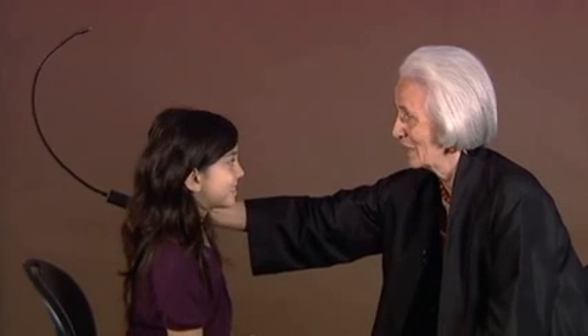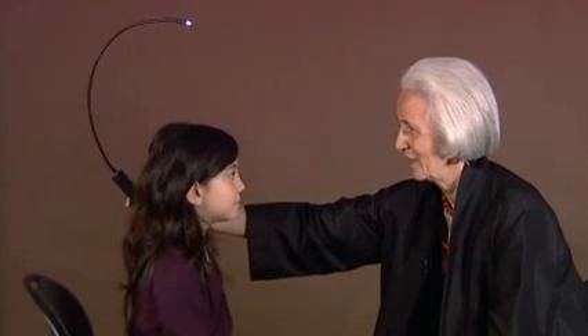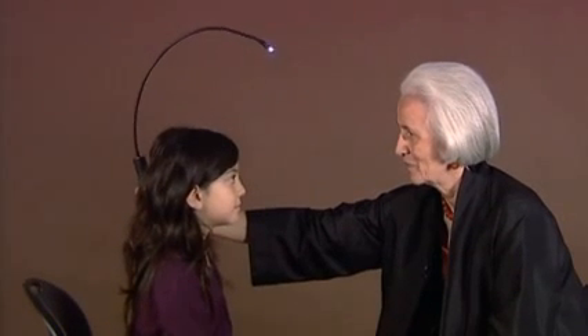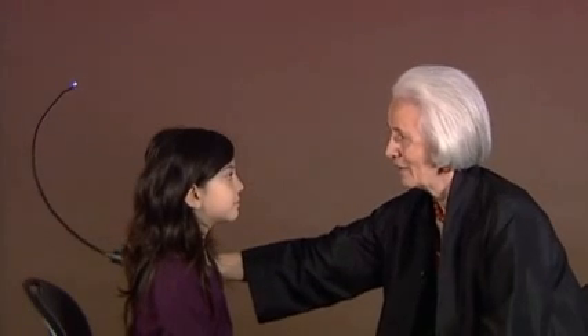You can look at it when it comes. Look on my nose, and then when you see it somewhere, you can look at it. There it came. Look again on my nose, and then you see it. There it came.